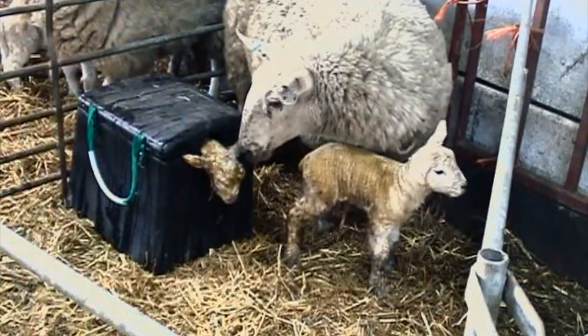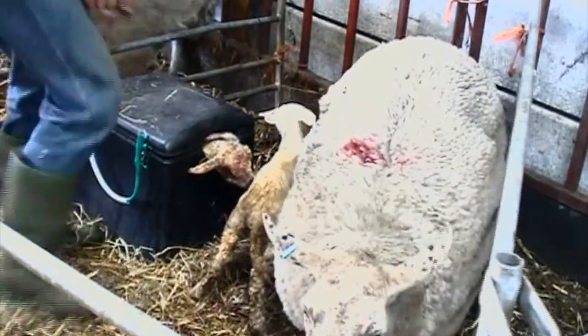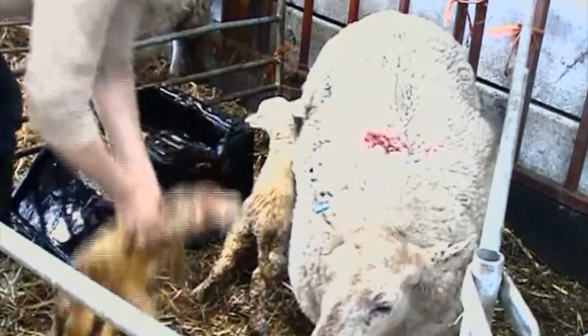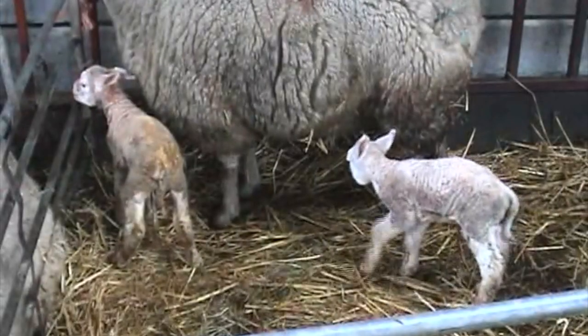Leave the Woolly Warmer in the pen alongside the ewe, so preventing mismothering. After about 30 minutes the lamb will have regained its strength and can feel its feet on the base of the Woolly Warmer and can practise standing. Quickly dry the excess water off the lamb and return it to the ewe.